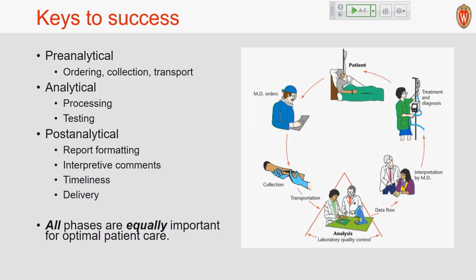Okay, so the keys to success are pre-analytical, analytical, and post-analytical, following details and doing it all right. Many of us have gotten into the laboratory profession because we don't want to deal with patients. We're just happy to be with our test tubes and culture plates. So it's easy to forget that there's patients involved, right? And there's physicians, and they are our customers, but they are also our colleagues in getting this all right. And so we don't think about these pre-analytical things. It's easy to forget them.